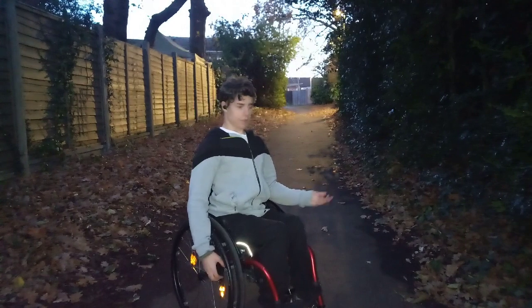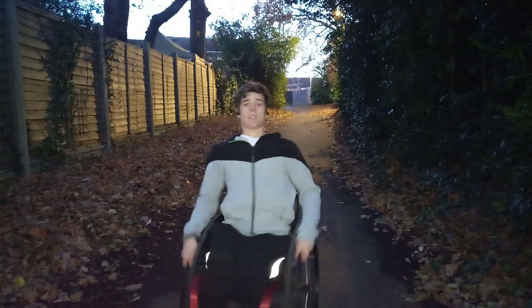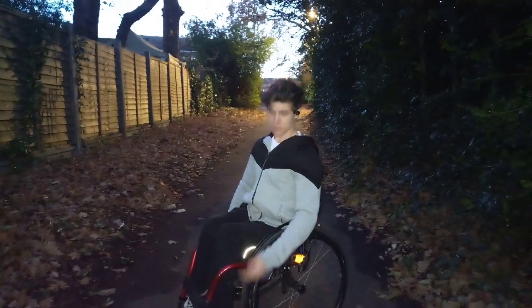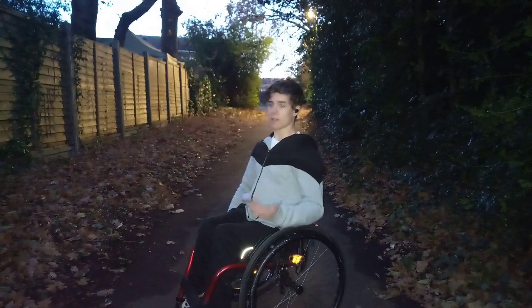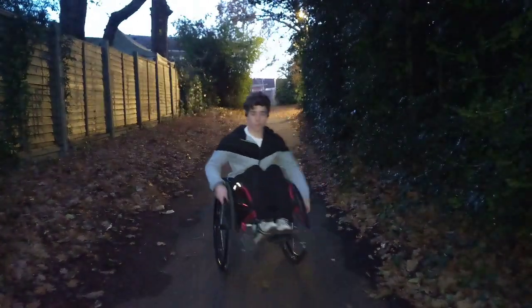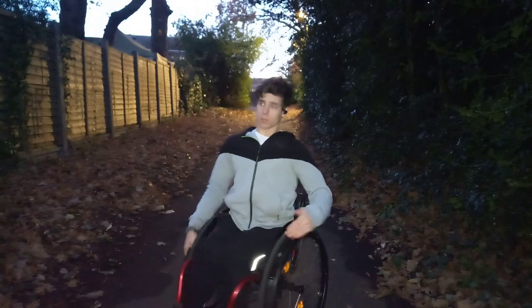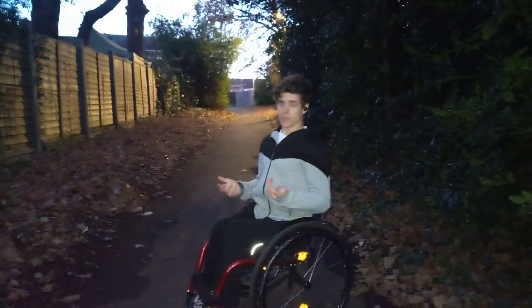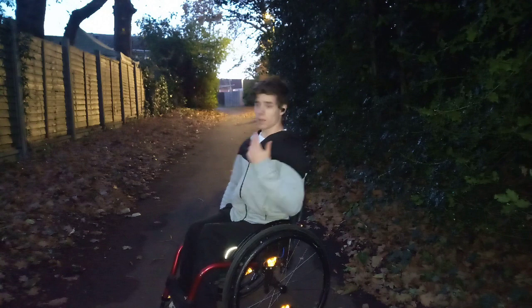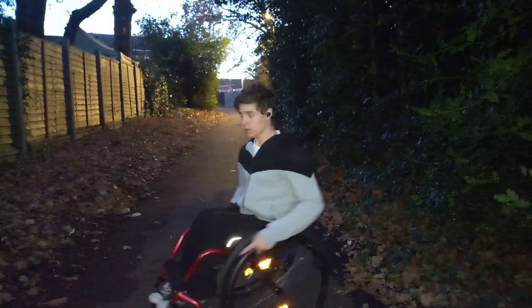But if there's any snow, if it's a snowier surface and snow is getting in the way and it's difficult to push, this relates to back wheel balance, because something I suffer with in the snow is that my front wheels will get stuck in the snow. So something I'd recommend is doing back wheel balance. That's just the best thing to do, back wheel balance and slowly pushing. Obviously, it's a little bit harder to do if it's snow and ice, but usually it's one or the other, so just keep in mind that if there is any ice under the snow, it could cause some issues. But every time I've experienced a snowy surface, I've been able to just do a back wheel balance.